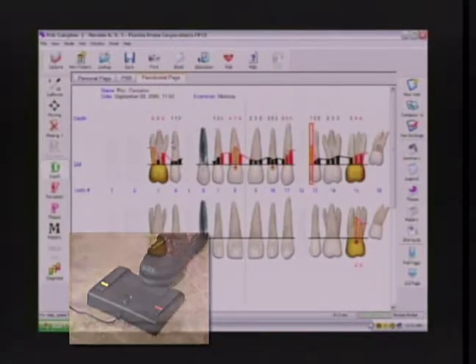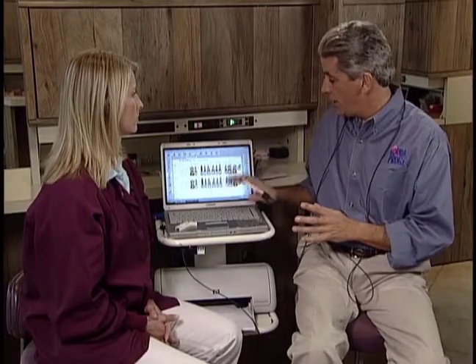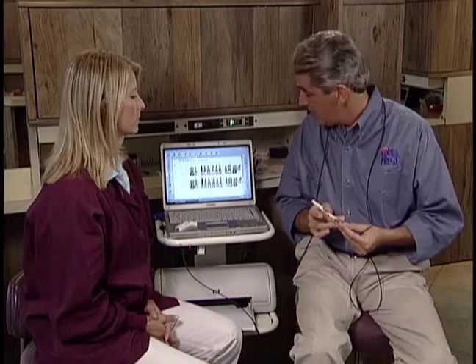Entering pocket depth. Now I can record my bleeding and use the center pedal to advance without changing data. As long as I'm not measuring, I'm not changing data. But even if I wanted to reprobe a site, I could put the cursor there with the moving mode and reprobe it.